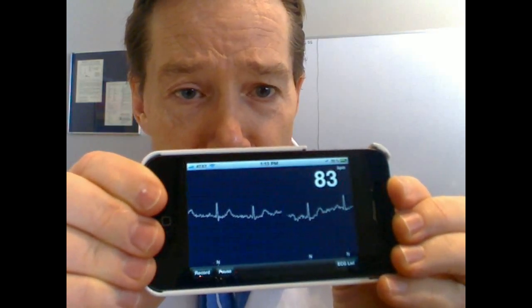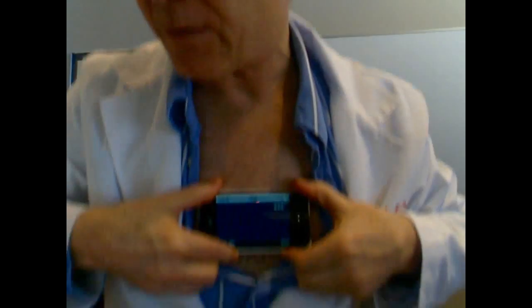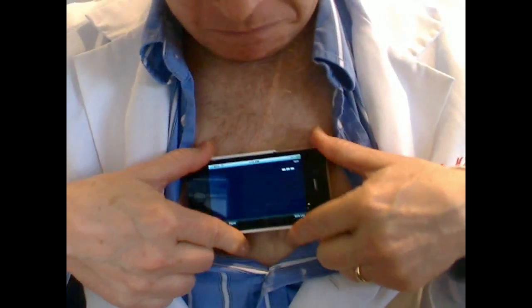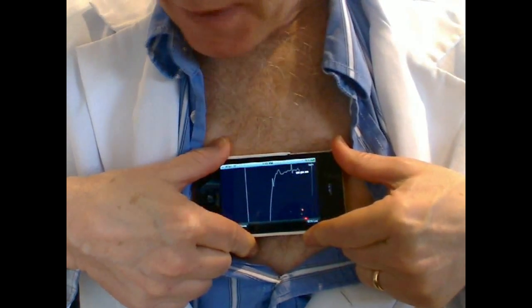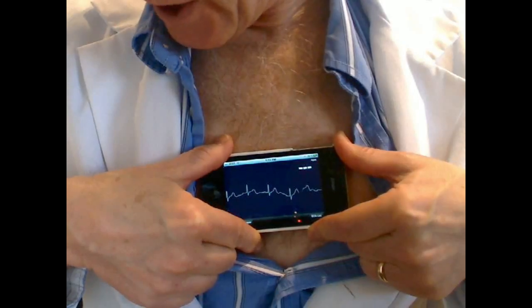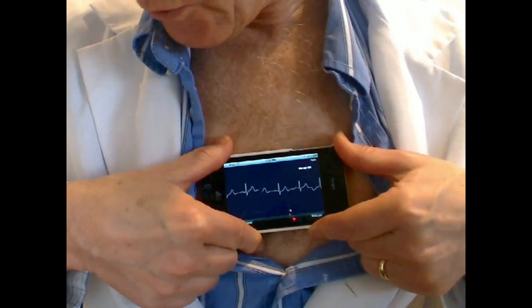Next I'll show you on my chest. So I take the device, I open up my shirt and I will now put it so you can see it on my shirt. There we go. And now you'll see a very clean ECG. The QRS detector will be detecting the ECG here shortly.